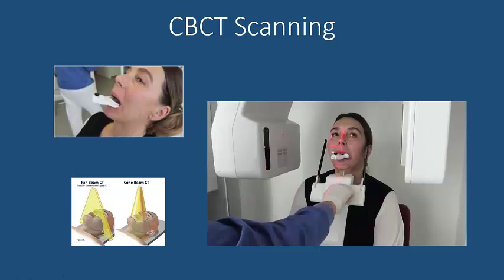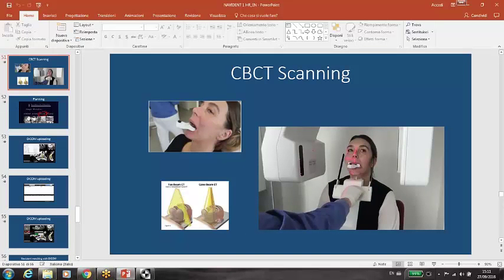You see? Okay. So the patient shouldn't bite it, right? But be aware that the patient gets tired. If you just tell him, keep it open, the masseter, the jaw muscles, get tensed and he gets tired. So he needs to relax his muscles. And how can you relax? If you can bite softly on cotton rolls, you get the muscles cooling down.